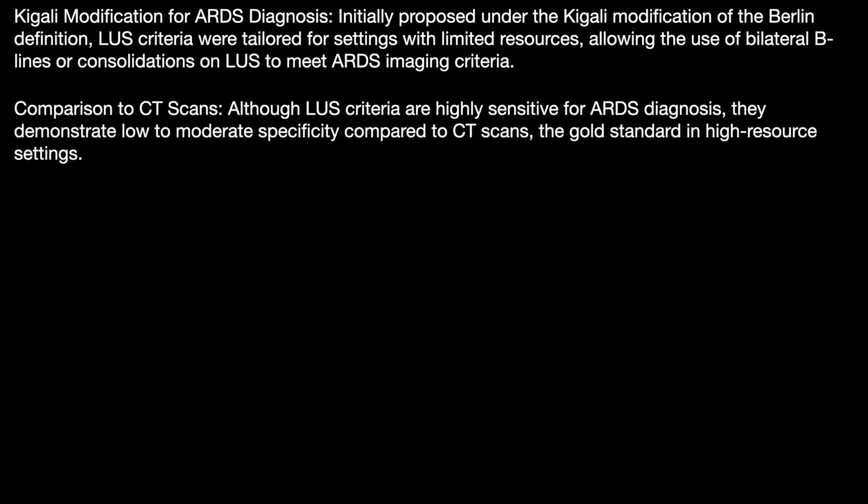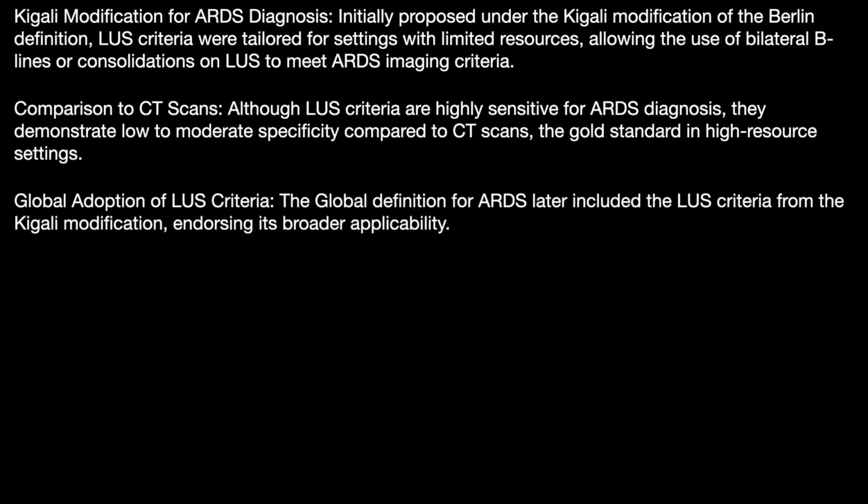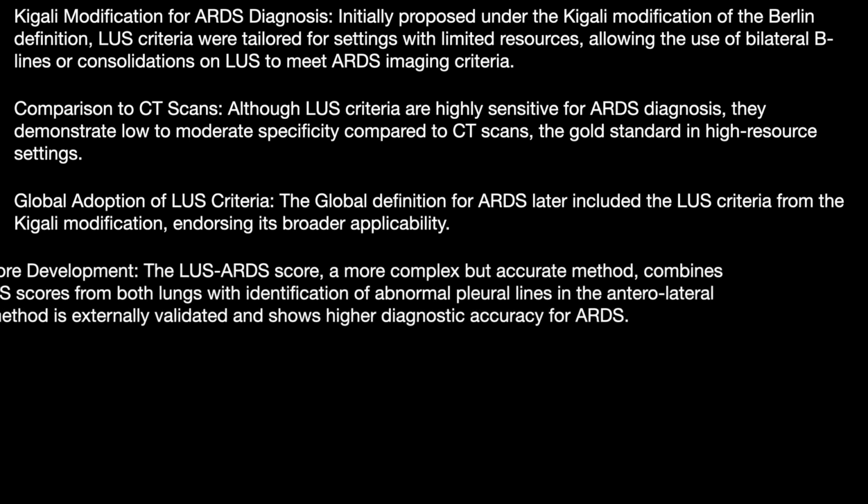Now, comparisons with the CT scan. Although lung ultrasound is highly sensitive, it demonstrates low to moderate specificity, especially when compared to CT scan, which is the gold standard in high resource settings. Now, the global definition of ARDS later included the lung ultrasound criteria from the Kigali modification, endorsing its broader applicability.